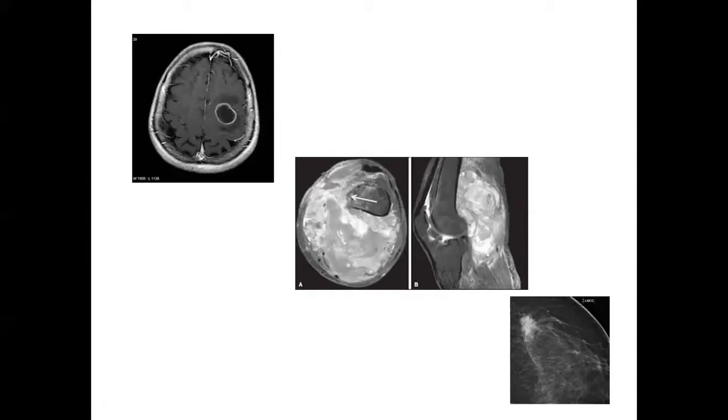Now, in the middle, we have an image of an MRI with a soft tissue mass behind the knee. An orthopedic surgeon came into my office not long ago with such a case, a mass in the synovium behind the knee on MRI, and he wanted me to give him some information. Orthopedic surgeons are excellent at anatomy and pathology. So I said, I'm afraid it's a mass, it's either benign, malignant, primary or secondary. And he said, yes, we'll send it off to the specialist hospital for biopsy. That's all I could say about this.